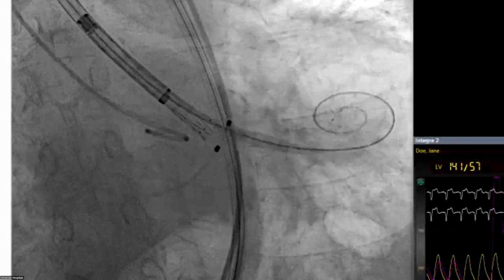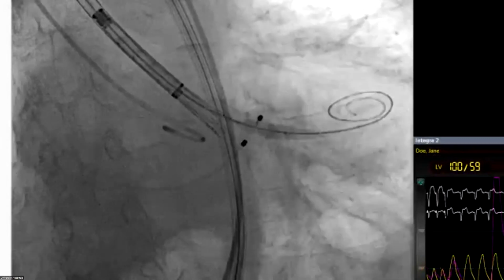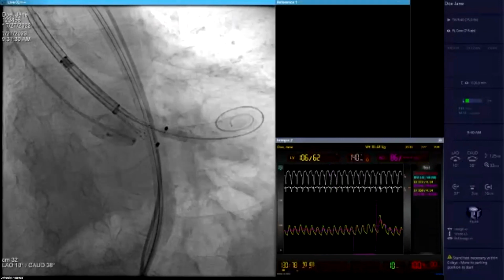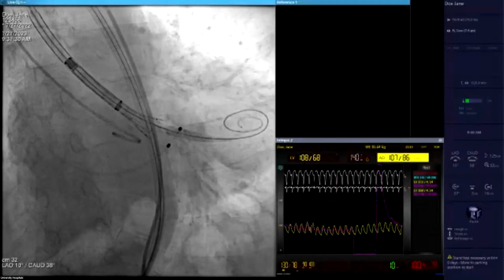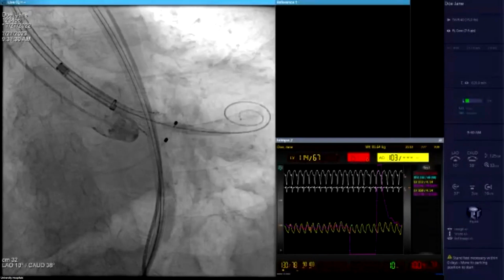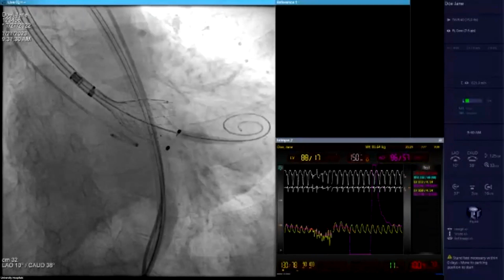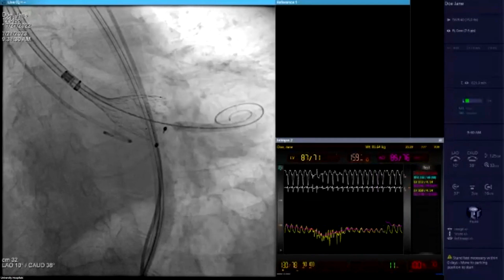Pacemaker on and 140, please. Now we're gonna start pacing to keep us systolic around the hundreds. Right to Puff there, Hitesh. Puff. 150. Puff. You still haven't made contact on the other side. 160. So now, yeah. Is it push? No, I did not. All right, pacemaker off.